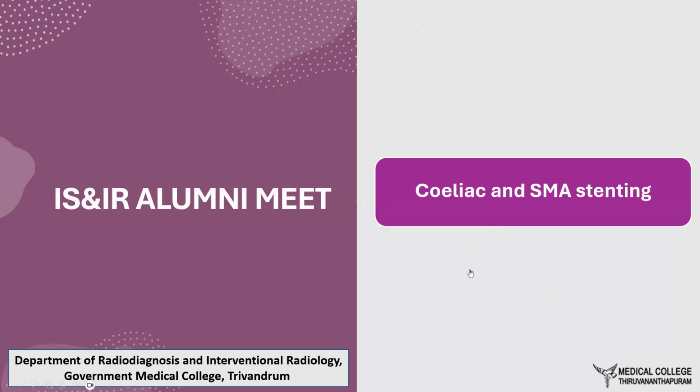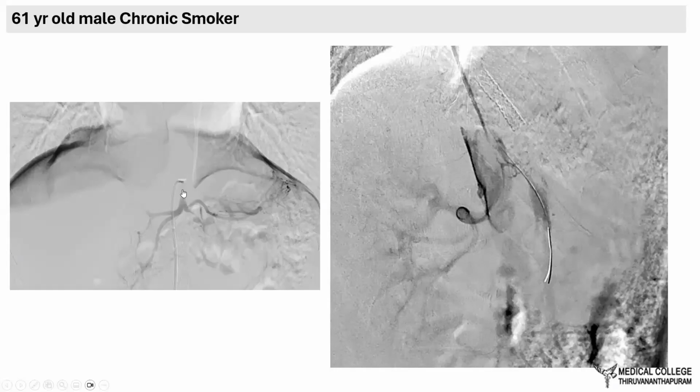So this is a patient of chronic mesenteric ischemia. This was the initial angio that showed tight stenosis of the celiac origin. There was an occlusion. This is the post-crossing angio. So this was an occlusion involving the SMA.